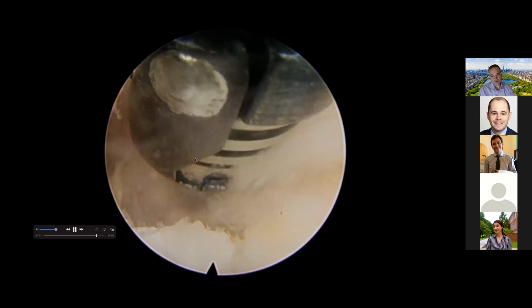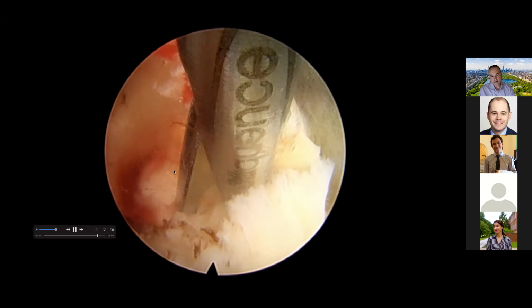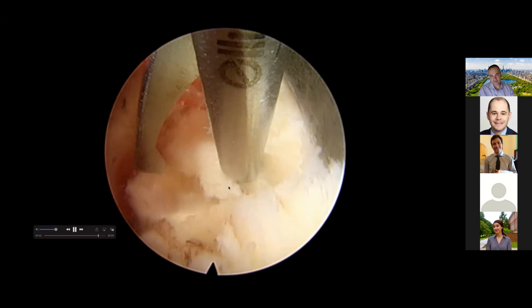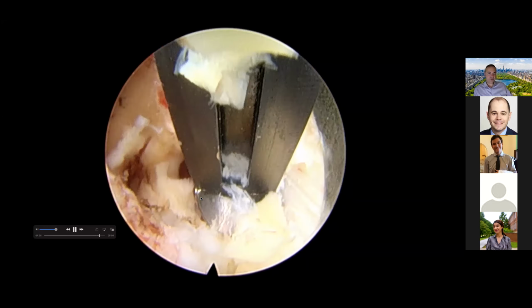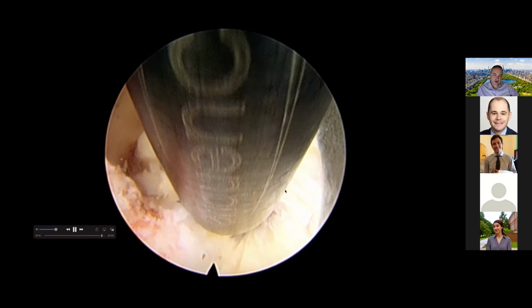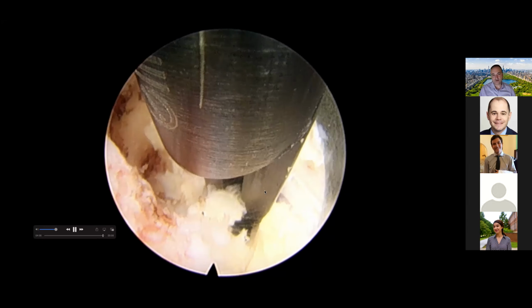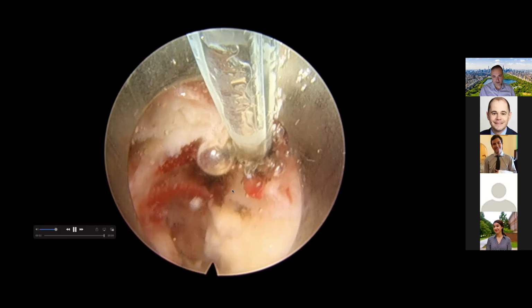And we're removing more of the bone, and now we're removing part of the ligament. You see that over here we went into the canal. Okay. Now we're using the Kerrison. On this side, we selected to remove all the ligament to see the nerves. On the opposite side, we didn't do that because on the preoperative MRI, the ligament did not appear to be very thick. On this side, it appeared a little bit thicker, so that's why we decided to remove part of the ligament, and the nerve was right deep inside there.